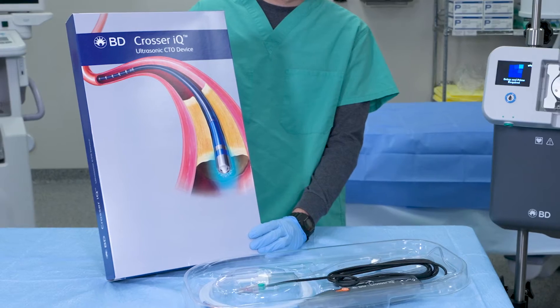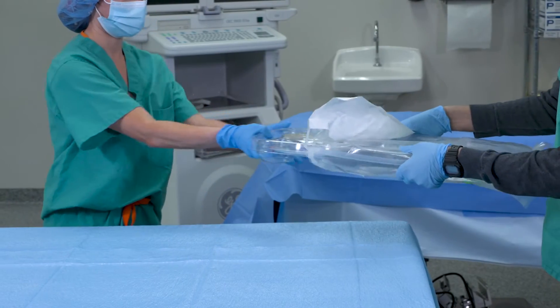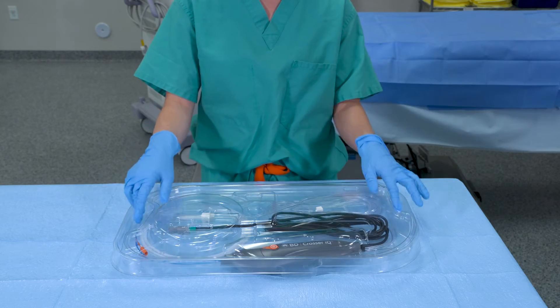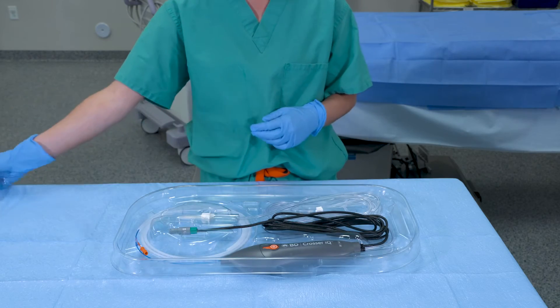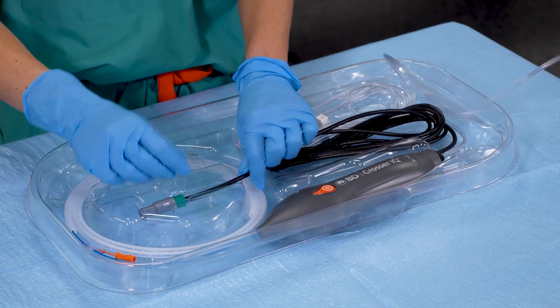Now that the BD recanalization system setup is complete, let's locate the Crosser IQ Ultrasonic CTO device. Remove the tray from the pouch and place the device in the sterile field. Then remove the retainer insert and the Crosser IQ Ultrasonic CTO device from the tray.